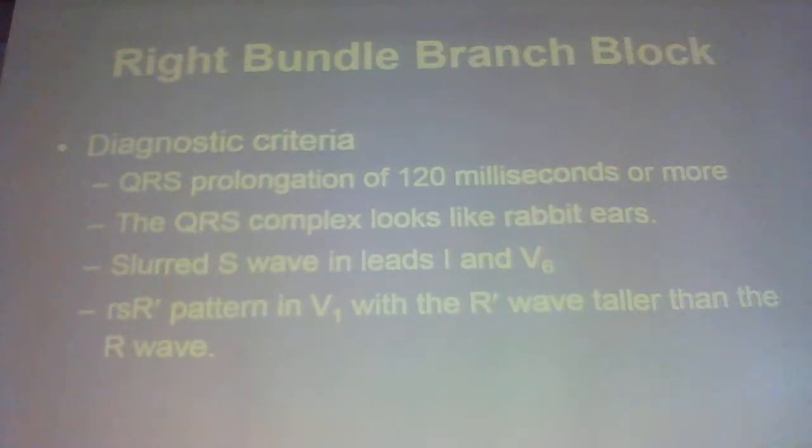Okay. Yep. So for axis deviation, is it only referring to electrical activity and nothing to do with the physical location of the heart? Like if the heart was moved, like in pregnancy, where the heart can get pushed up and turned a little bit, would that show as axis deviation? Yep. And if you had your patient laying on their side and you did it, absolutely, it could change it. It's not going to change it significantly, but it could. That's why it's so important to get your V leads in the proper anatomical position.